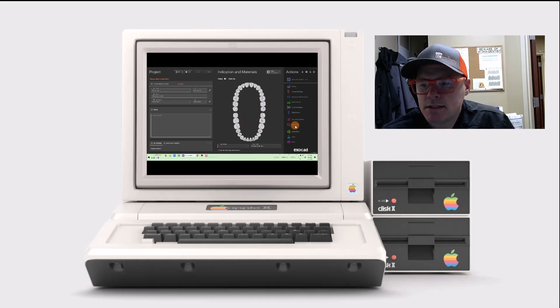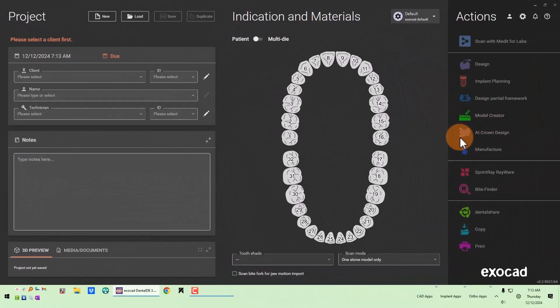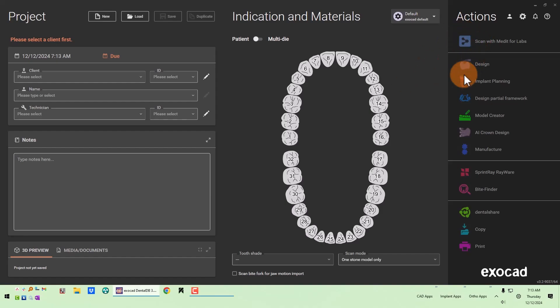You can see here on the right side we now have this option: AI crown design. I'm going to show you how you can enable that icon so that you can use the AI crown design, and then I'm going to show you how it works.